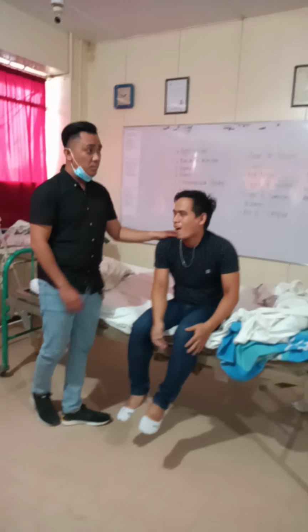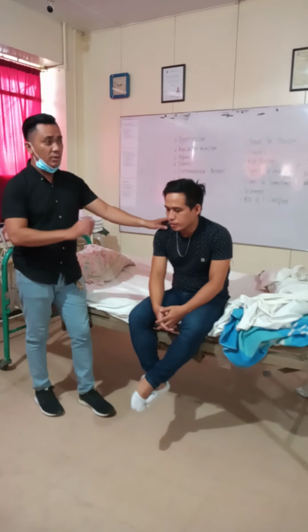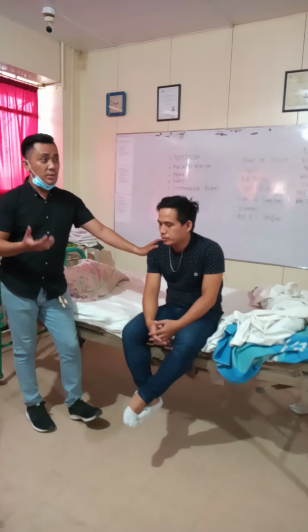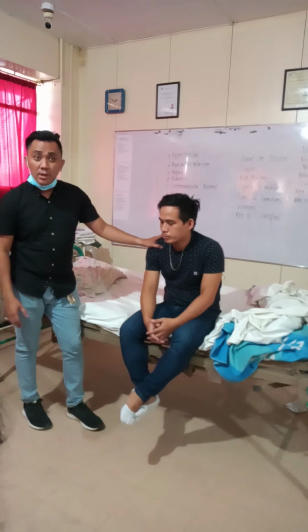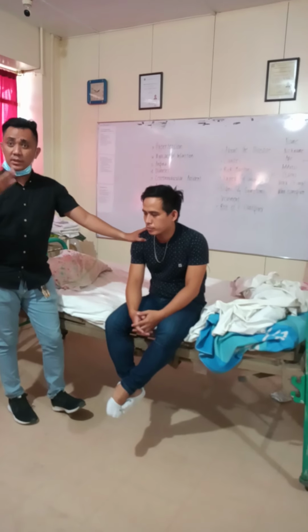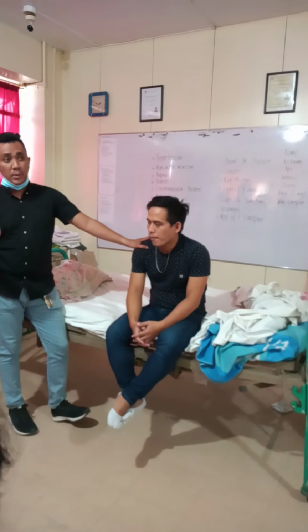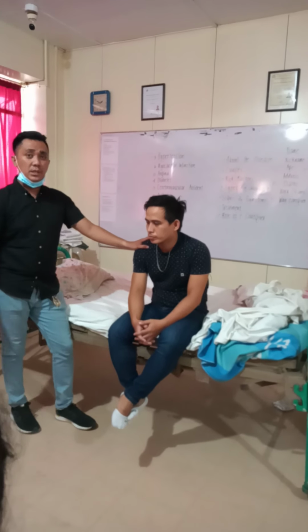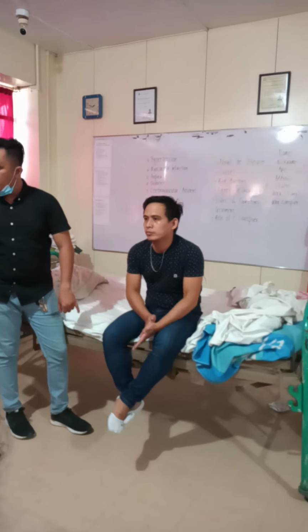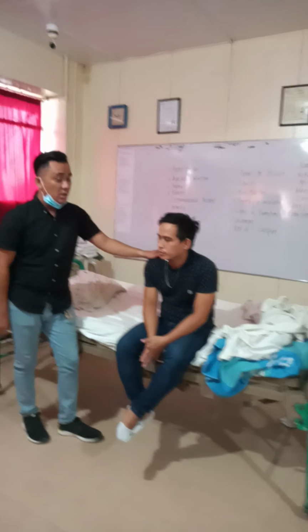Once the patient is in a sitting position, ask your patient, sir, nalipong ba ka or wala? Okay? Now, why do you need to ask if nalipong mo siya or wala? So if ever the patient is nalipong na siya, there's a possibility yung blood pressure is naubos po na siya. So let the patient rest. Okay? If the patient still feels dizzy after pila ka seconds or minutes while the patient is at rest, then check the BP. If the BP is too high or too low, then put the patient in a resting position. Bigdaan na lang siya, balik ay papawaya. And monitor the vital signs. Gets ninyo? Okay? But if the patient doesn't complain about dizzy, then continue with the procedures.